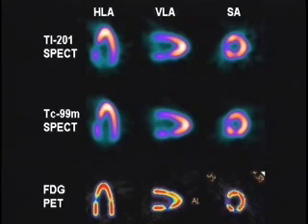But this, for example, is showing 3 different isotopes, 3 somewhat different techniques, with the heart sliced different ways, showing what the different isotopes look like for those particular studies. And if you look at the top row, for example, it should be a complete upside down U. All right. And it's not, so that means that the left half of the heart, which is probably the septum, is not getting good blood flow at that physiologic state, whatever it is. I don't know if it's a rest image or a stress image.